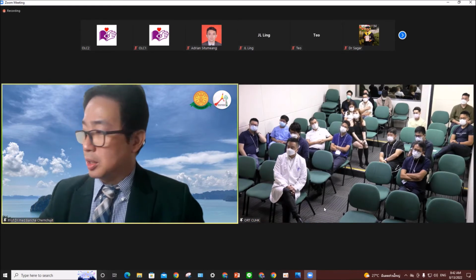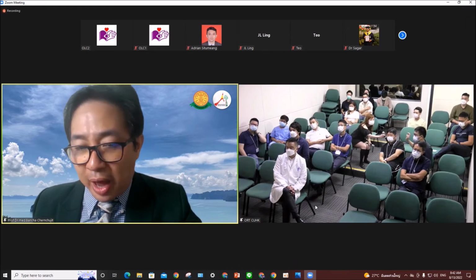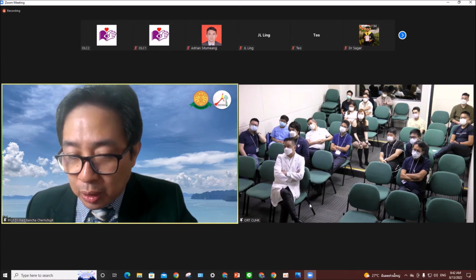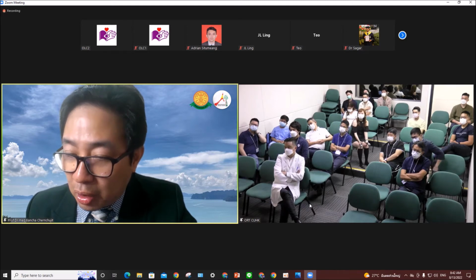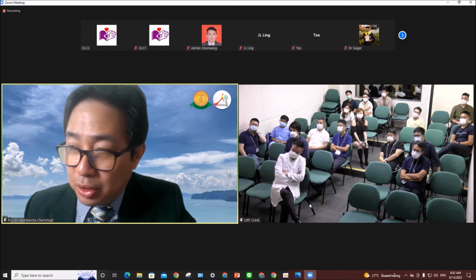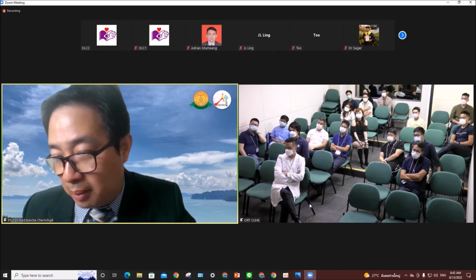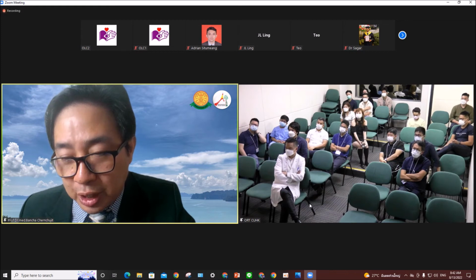Okay, very good question. That's the study from Sugaya from Japan. Even if this fragment is very chronic, don't give up. You go in and detach this fragment using the chisel or Bankart knife to break it, and then reduce it back. Even if it is chronic, we have no time limit, because this fragment, even if it's small, can get bigger over time, like I showed you in Sugaya's publication in JBJS.